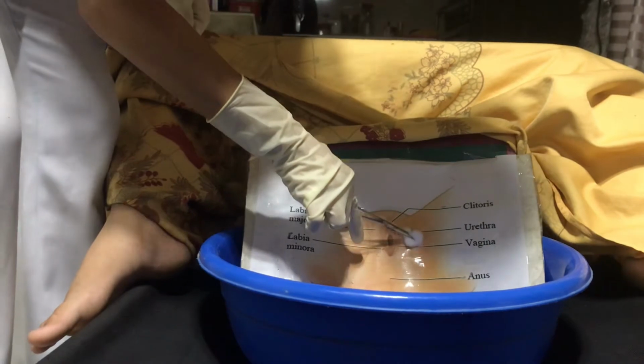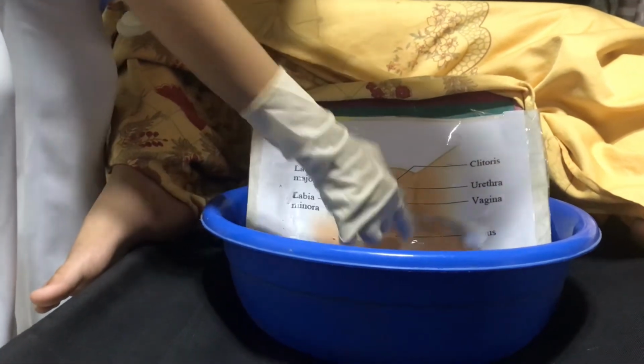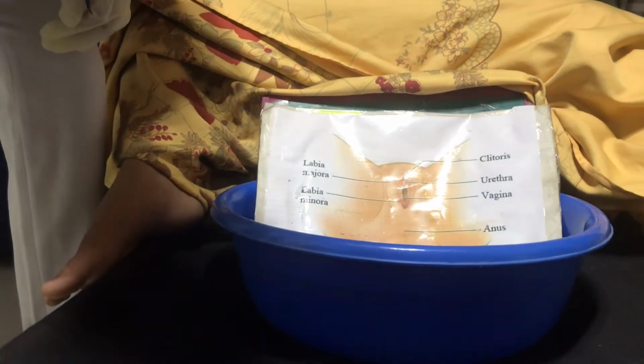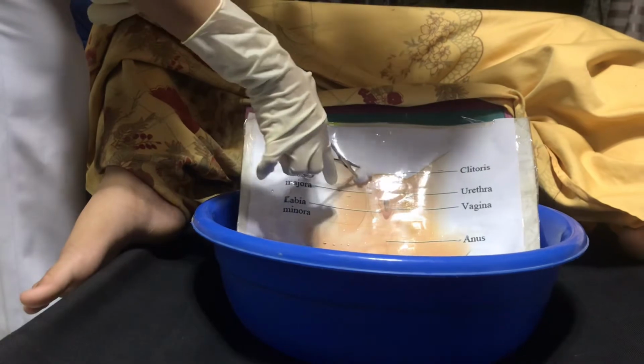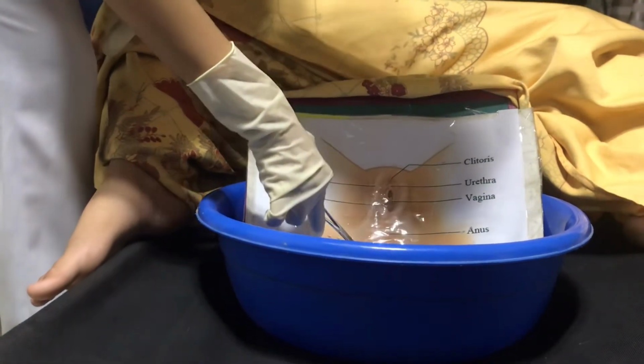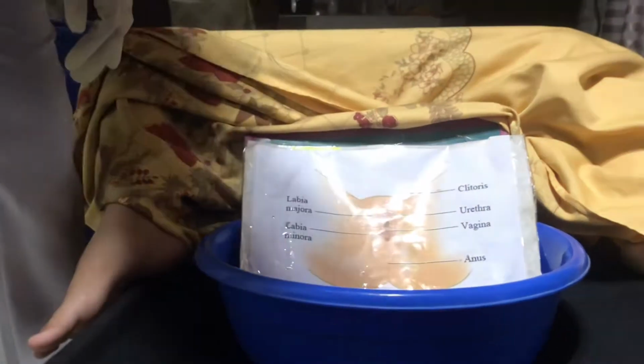For the groin, from up to down, up, down, up, down, up, down, then discard. The other one, do the same: down, up, down, up, down, up, down, then discard.